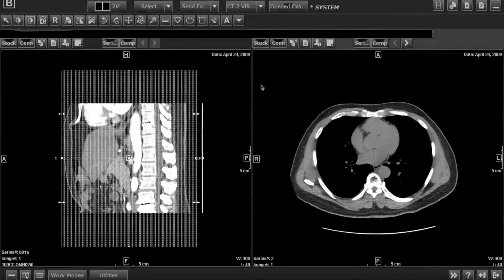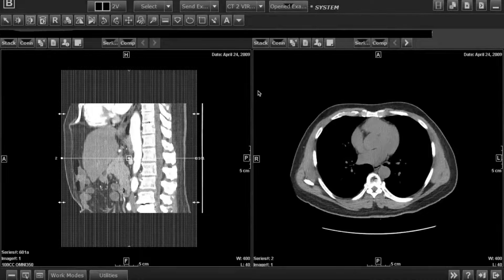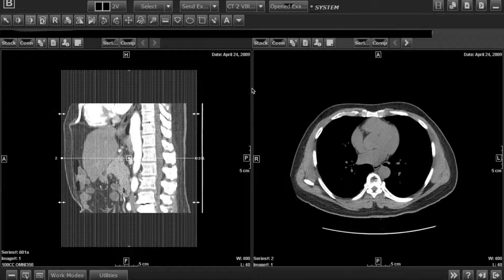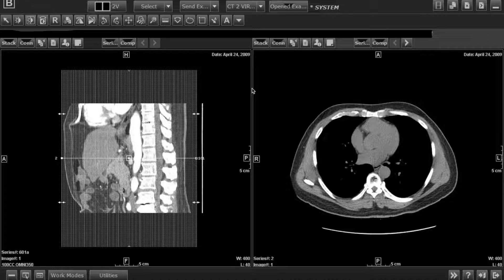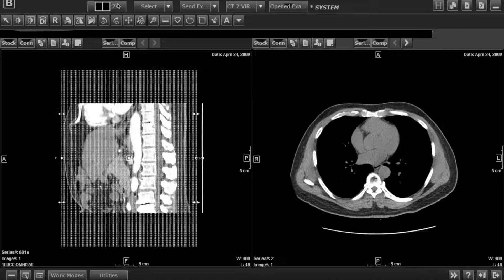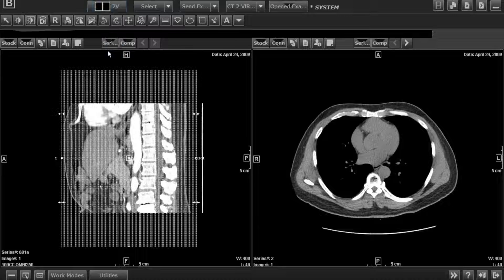The selection of the L3 vertebrae protocol is completed within GE Centricity. Be aware that if using a different software, the tools may vary. Open the patient's CT or MRI images done within the time frame of interest, then select Monitor Regions 2V Window View.